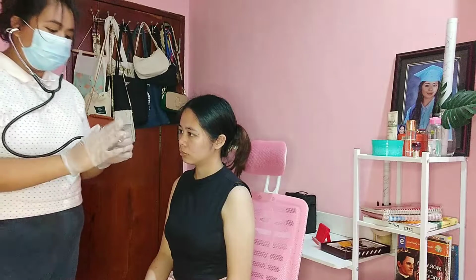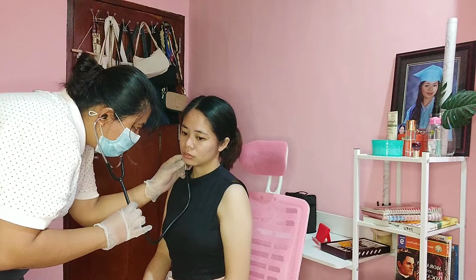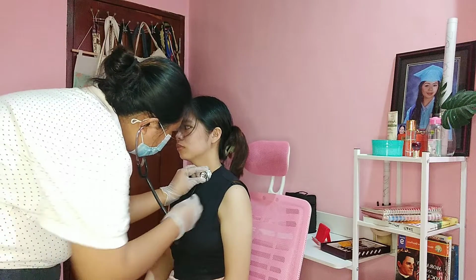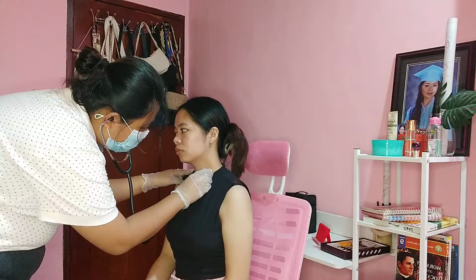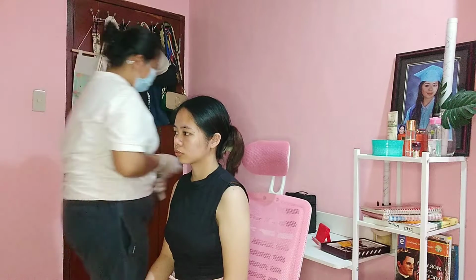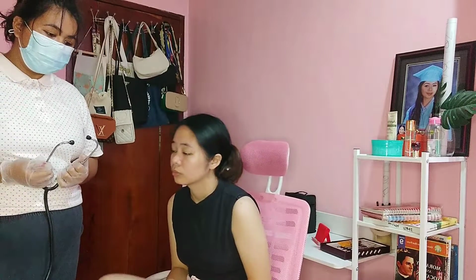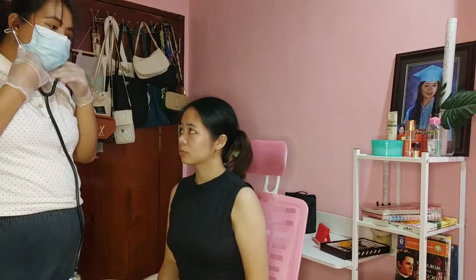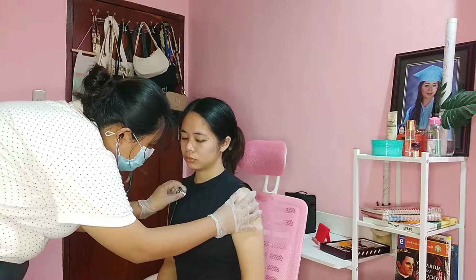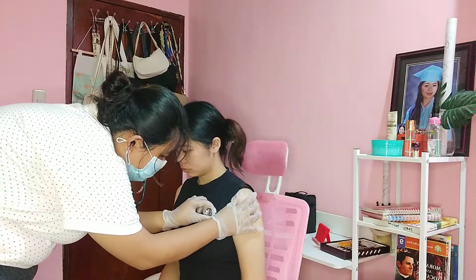I'm going to use the diaphragm again, ma'am. And then last, we're going to auscultate the anterior chest.